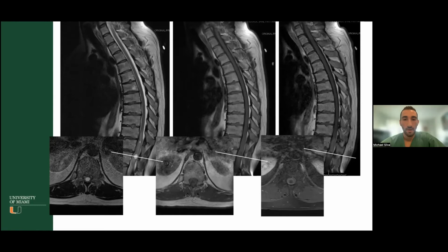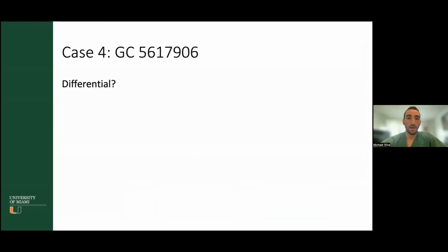Good. So there's a non-enhancing or maybe mildly enhancing lesion with a cystic component, and it's right at the conus. So what's on your differential for a tumor in this location? You already described it as an intradural intramedullary tumor, which is good. Most commonly you would think about astrocytomas, hemangioblastomas, mets. There's a very important one you haven't mentioned, at the conus.